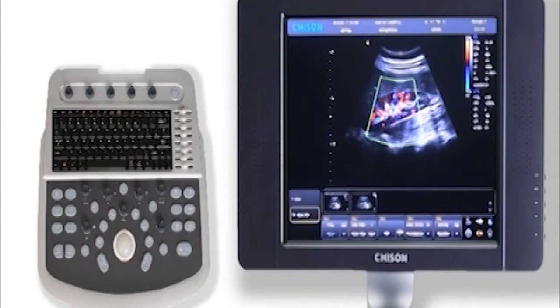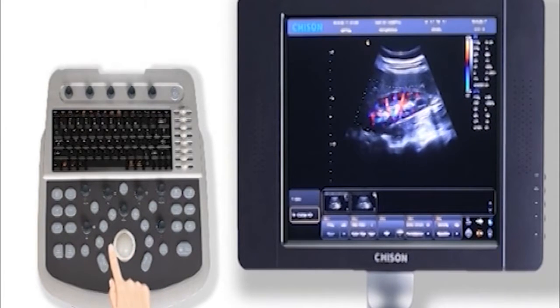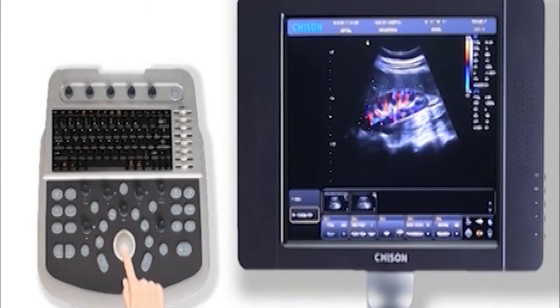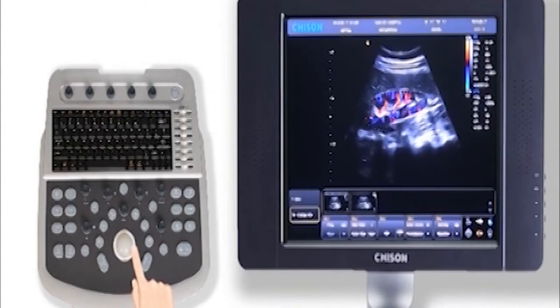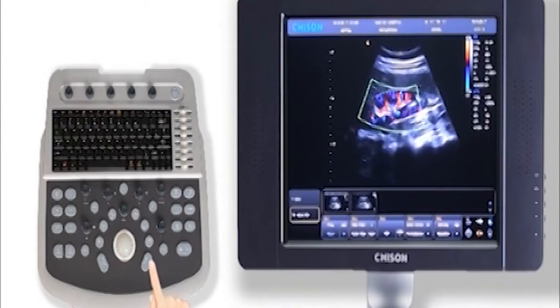Press the enter key once and move the trackball. We can change the size of the interest box. Press enter key again, it will be fixed.